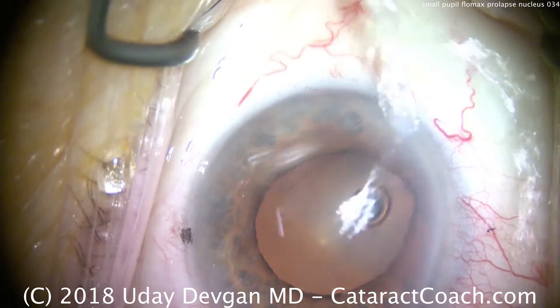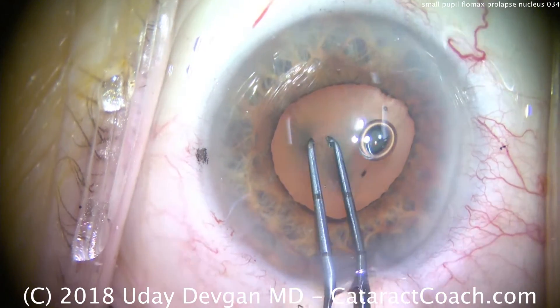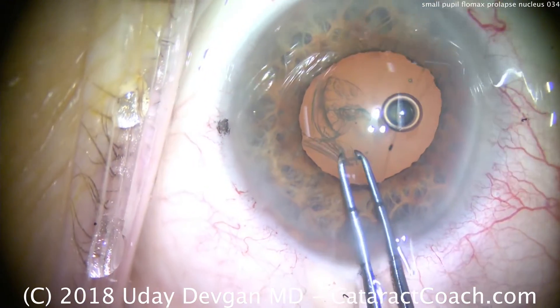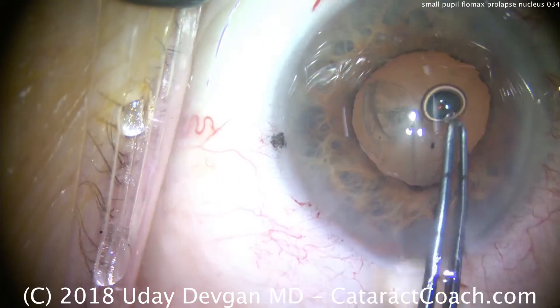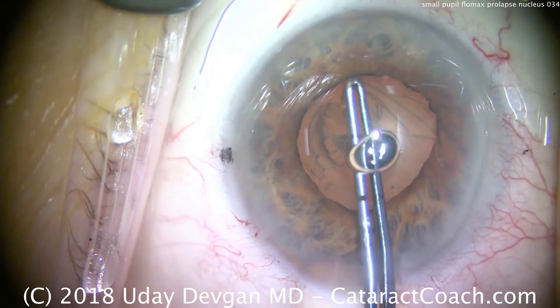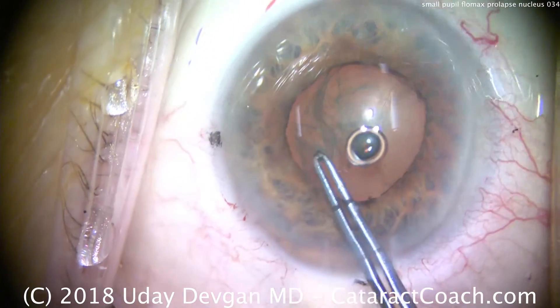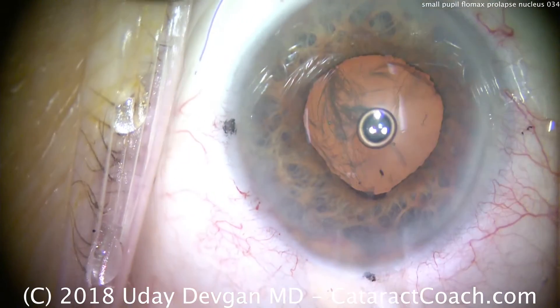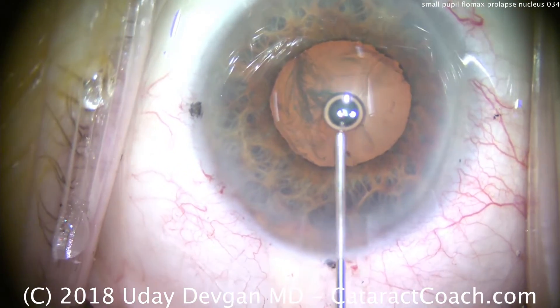Now we switch over to a brighter red reflex and use our forceps to start our capsulorrhexis. This is still only a pupil of about 4 millimeters, maybe 4.5, so we're going to have to make the rexis larger than the pupil. As I continue this around 360 degrees, you'll notice that not even once will you see the edge of the rexis — so we are definitely making a 5 or even 5.5 millimeter capsular rexis in this patient. There's the completion. Oh — a little movement from the patient; he just wants to help us do the rexis.